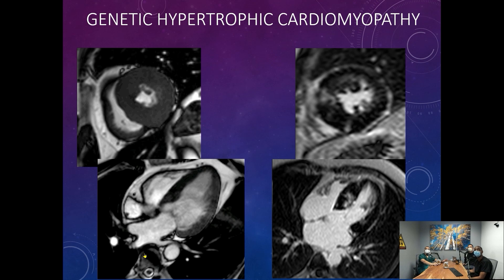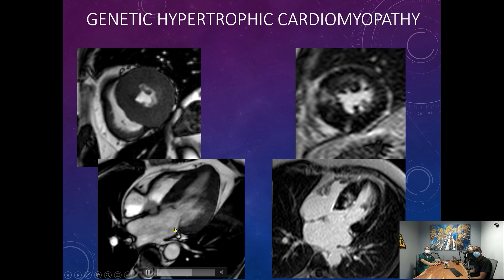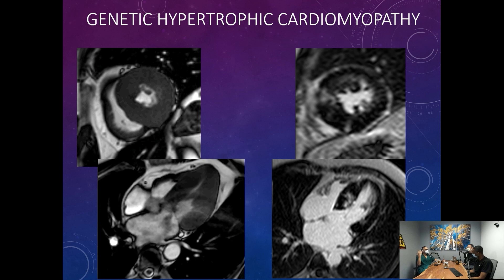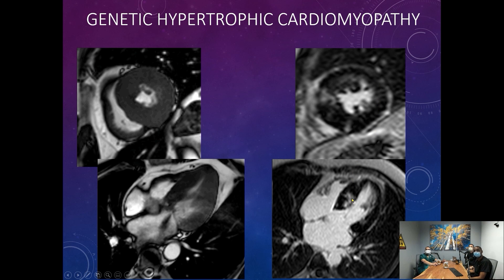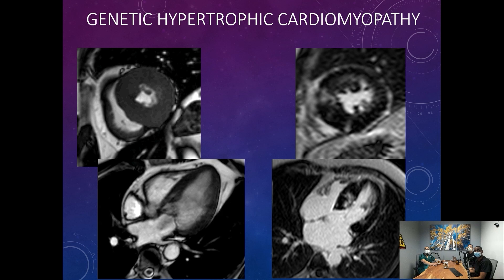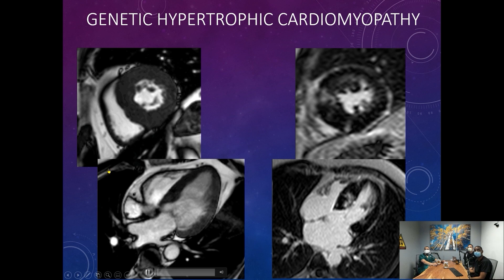Here is an example of a different patient with hypertrophic cardiomyopathy. You can see this patient has what we call systolic anterior motion of the mitral valve; the function is good, resembling our patient's. When we give gadolinium, sometimes scars develop within the myocardium due to a mismatch between blood supply and demand. These scars are seen with late gadolinium enhancement — here in the septum, not corresponding to a coronary territory, occurring in the thickest areas where hypertrophy is most severe.